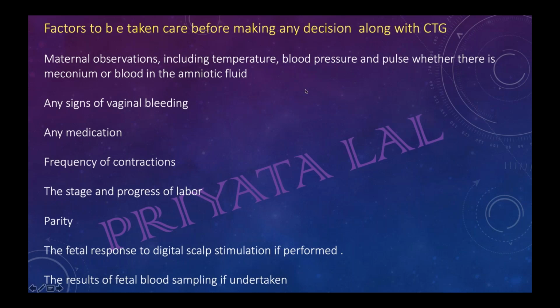So you cannot decide on the basis of CTG alone. If I send you a CTG on mobile WhatsApp and ask you to guide me, you cannot, because you don't know the condition, PA, PV, or the general condition. So it is a combined decision of the patient and CTG together. Never is any decision taken only on CTG reading.